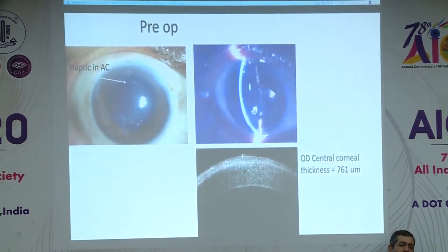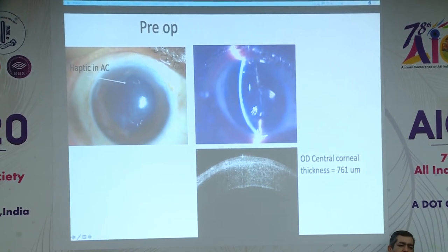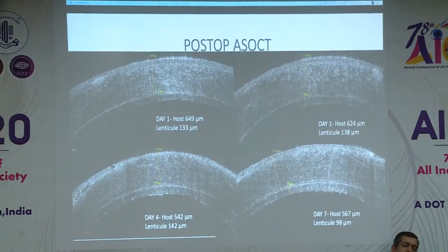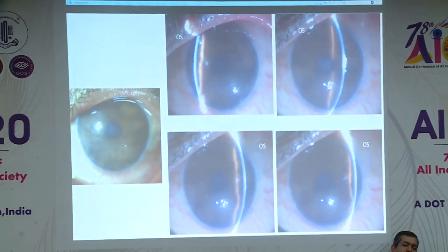Yeah, so this was the case which I showed you, which had a bullous keratopathy. You can see the haptic is lying over the iris. I was not sure about the PC status. This is the pre-op corneal thickness, which is 761 micron. And this is the post-op of 636. And this is the post-op AS-OCT 2020.